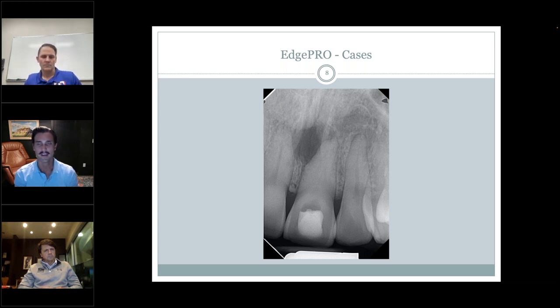And I know I'm talking mainly to endodontists and endo students, and probably some general dentists as well. When you access a tooth, in necrotic cases and vital cases, there's often a lot of gunk in the chamber. Sometimes you have a hard time seeing and getting your bearings and navigating the canal, at least to get the process started. So in this case, and in all cases, running the EdgePRO within the chamber opens things up, and it helps you see different nuances under the microscope, like changes in texture and color and clues that might point you to the area of the calcification.